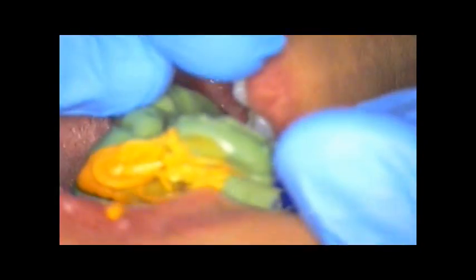Okay, so we're going to have her open. I'm taking the impression out now very gently. Notice I had her open the lower, the opposing, first, and then I teased out the upper. I just don't want to tear my impression in any way. So there's the impression. As you can see at higher magnification, we got a very detailed margin all the way around the tooth. And we also look for voids in other areas of the impression, and it seems like we're pretty good. And our patient is happy that we got this impression the first time around.